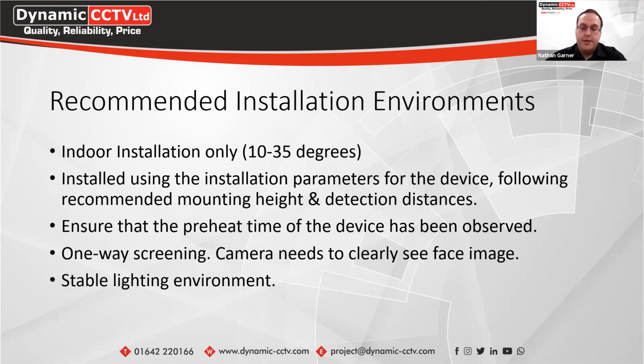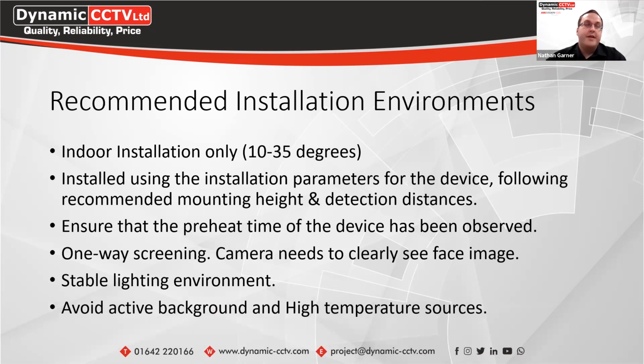They also need to be installed in a stable lighting environment, so there's no interference from the lights. It also needs to be a well-lit area that the camera's installed in. It makes it a lot easier with the optical image. If it's fitted in, for example, a foyer situation, if there's a lot of movement in the background or other high temperature sources, these can affect the accuracy of the temperature screening cameras.